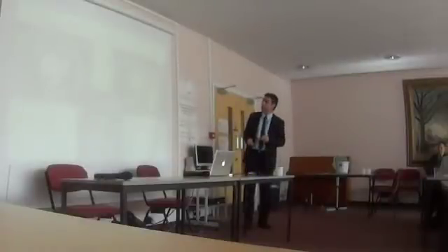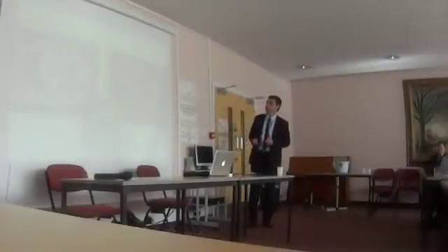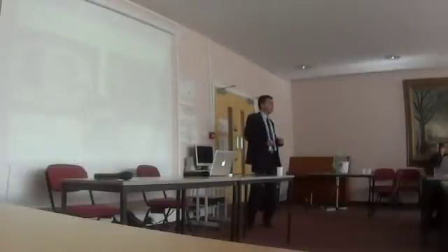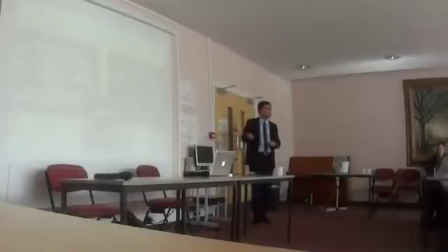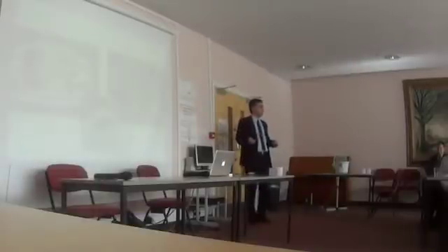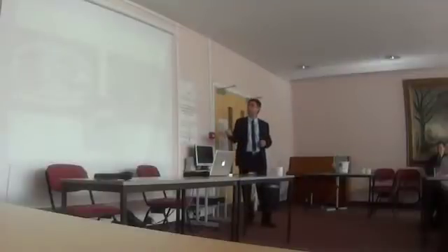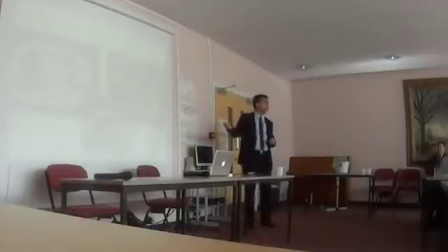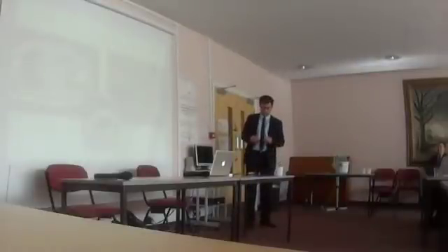So he came for the MRI. Again, function slightly low. It's not as good as the other ones. But when we applied the gadolinium, it was very interesting. We show a different pattern. You can see here, there's like a dot in the mid-septum and another dot in the lateral wall. This is the pattern we normally see in an embolic event, which means that there is a clot somewhere, we don't know where, maybe he had atrial fibrillation, leading to the stroke, and the heart at the same time. So it's very interesting. But now we have to direct the treatment towards an embolic event and to see what the cause was.